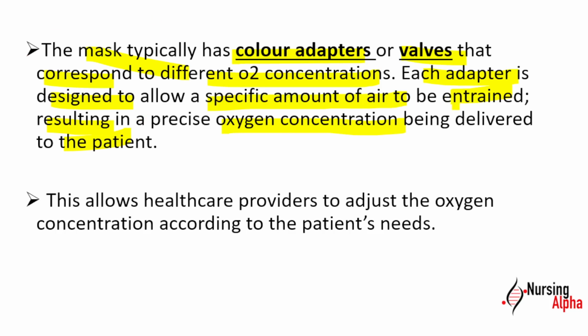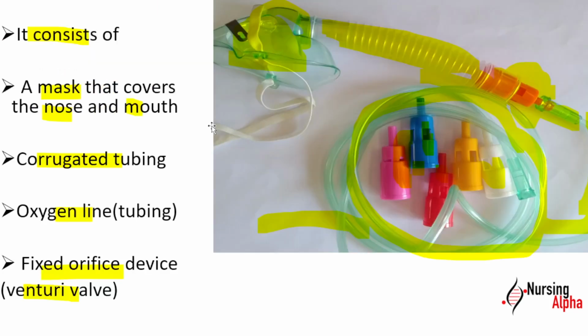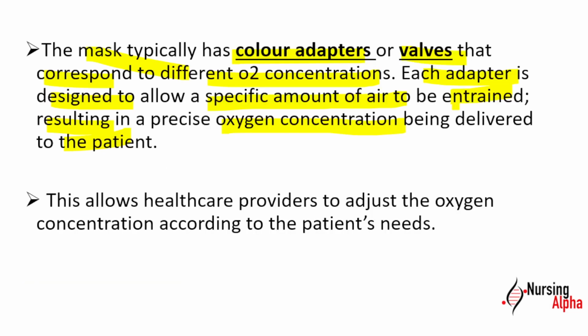You can see in these pictures there are various kinds of colors like white, yellow, red, and blue. Each and every valve has a different oxygen concentration.